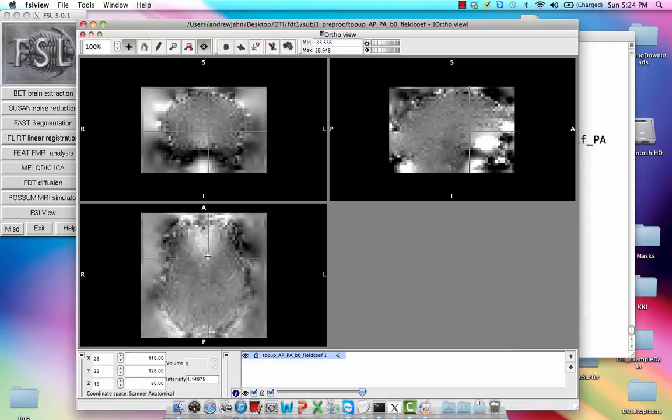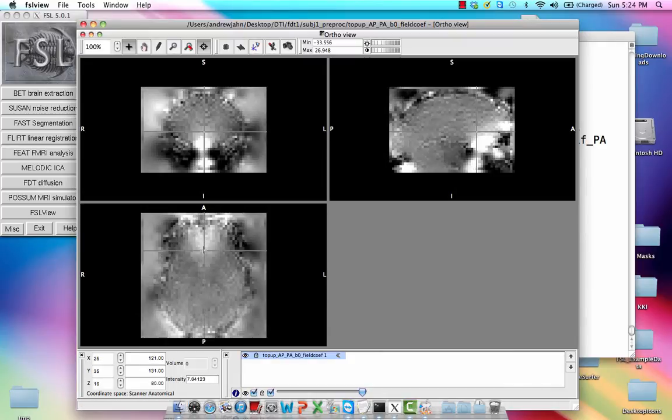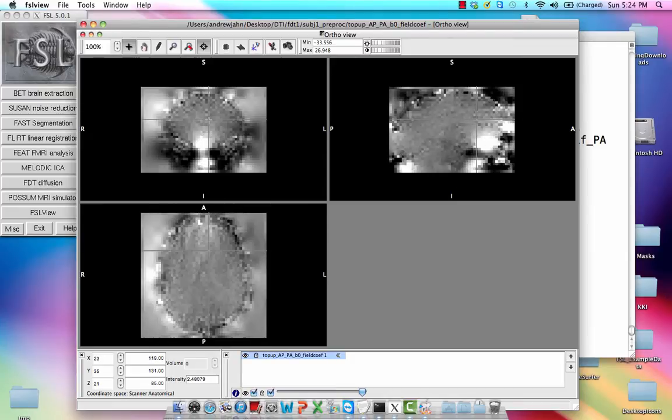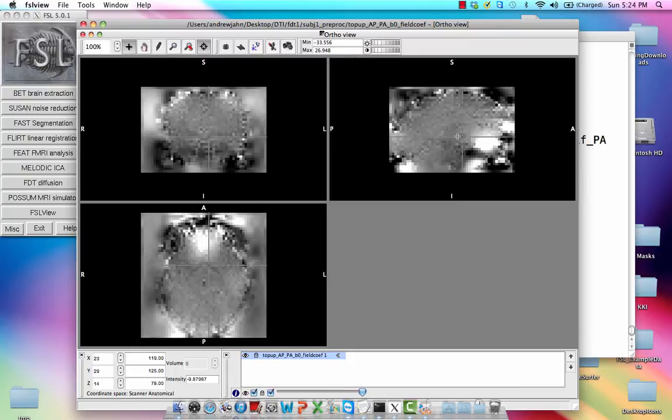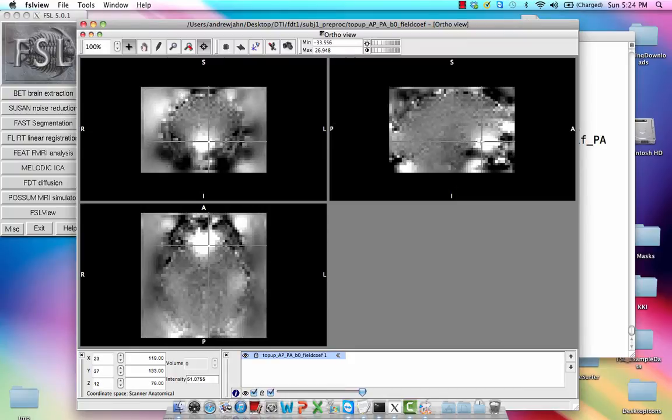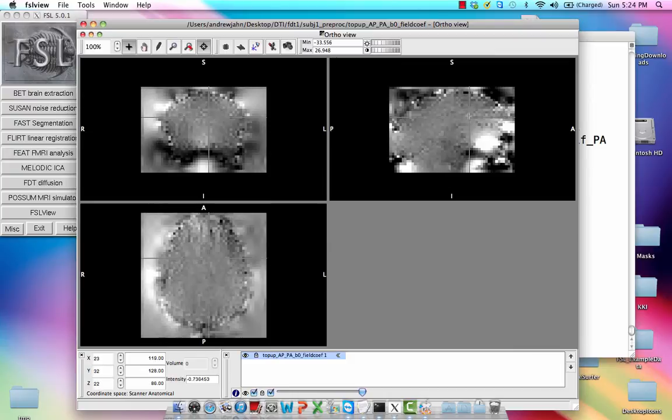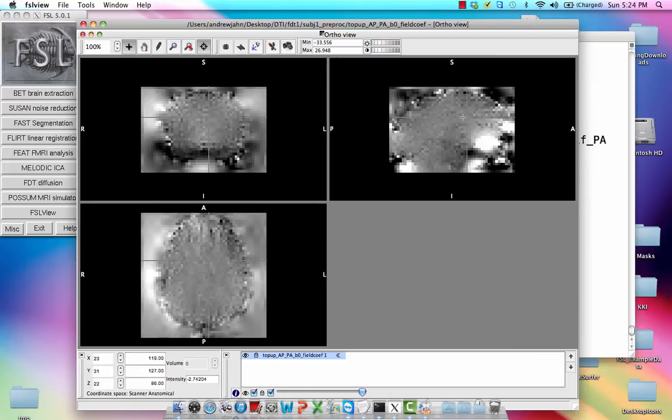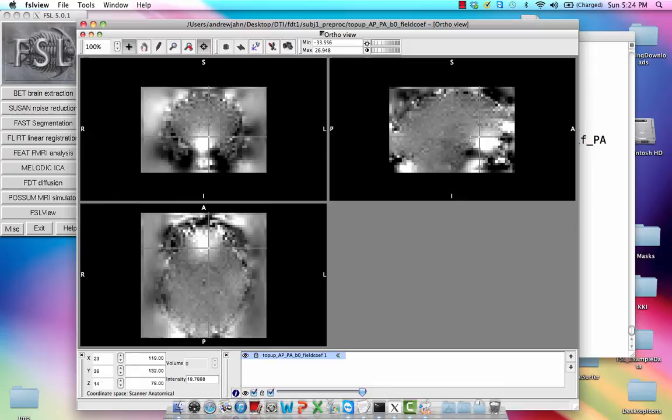you'll see that this looks a lot like a field map, which in both instances, both with the field maps and fMRI and with this, these maps that we have right here, these are estimates of the distortion across the image. And so basically we're going to try to do the reverse to undo all these distortion effects to get a cleaner image.